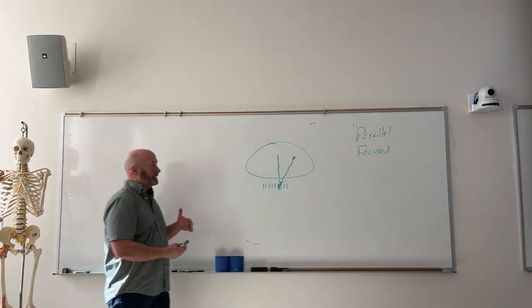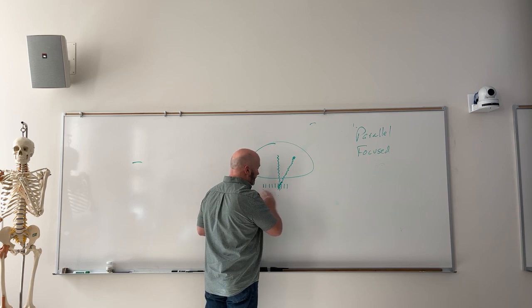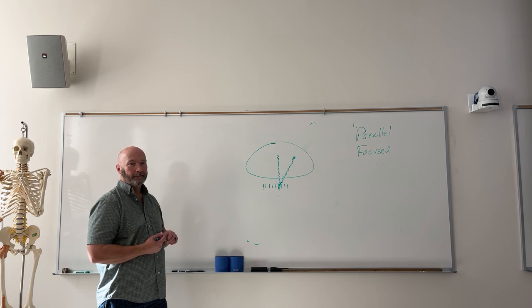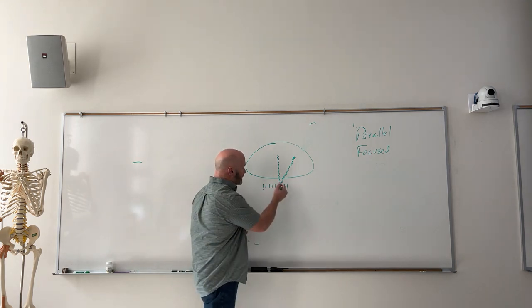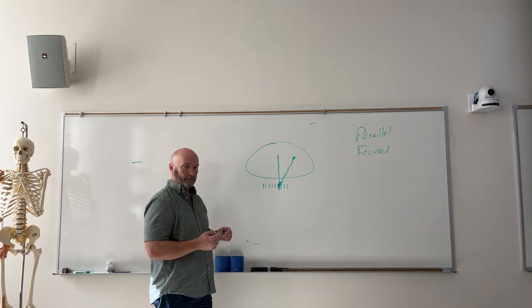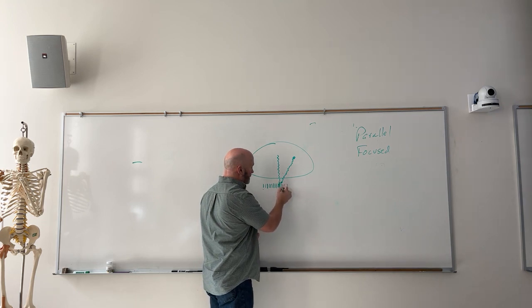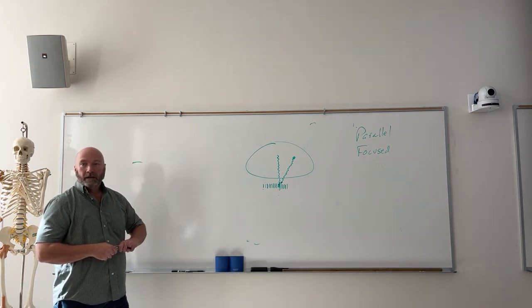So we can manipulate that, and if we wanted a thin grid like this, how could we make it to where it would absorb that X-ray photon? Could we do something? Just looking at that, could we do something where it would still allow this X-ray to make it through, but block that one? Closer together? What's that? Closer together? Very good. What if we added more grid strips? We'll put one right there. Would it block that one? It's getting kind of busy in there. It's kind of tough to see, but would it? Answer is yeah. Okay.